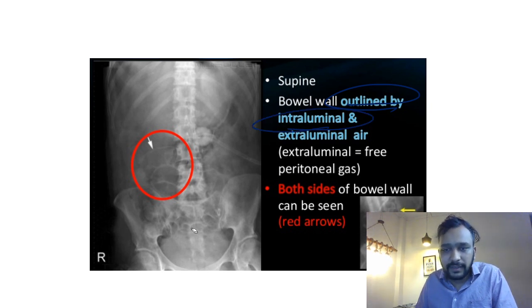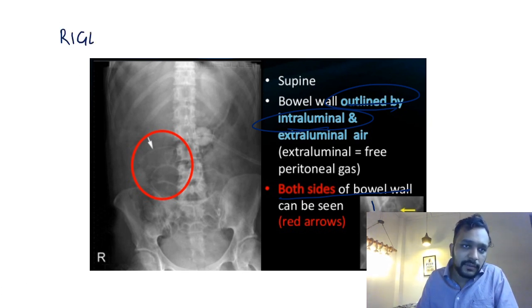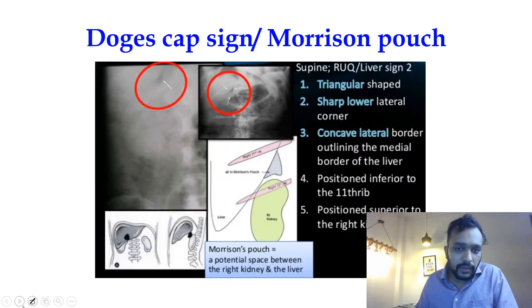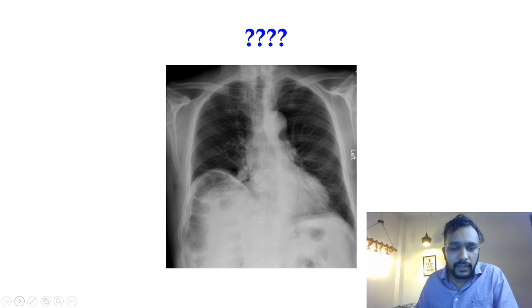Moving on to the next X-ray: the liver edges can be appreciated, known as the liver edge sign. When the walls of the bowel loops are outlined by both intraluminal and extraluminal air and both sides of the wall can be seen, this is called the Rigler's sign. When there is collection of air in Morrison's pouch, this is known as the Doge's cap sign.